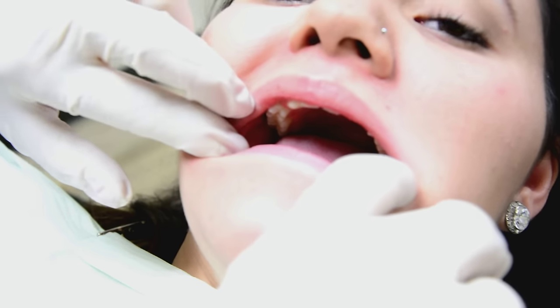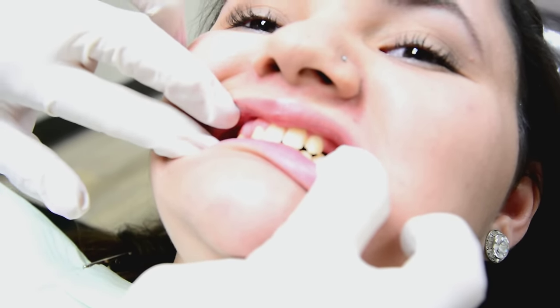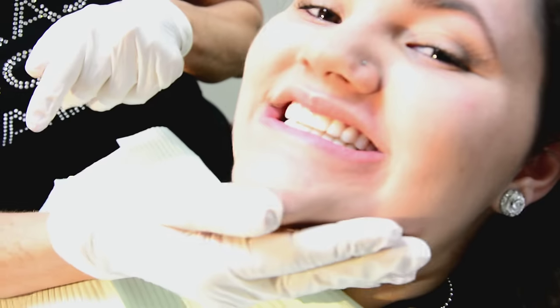If you notice, when she bites down, she has very small teeth. And when she smiles, you really don't notice her teeth. So we've opted to choose the snap-on smile to do two things: number one, give her a more aesthetic smile, and open up her bite just slightly so when she does smile, she'll have teeth.